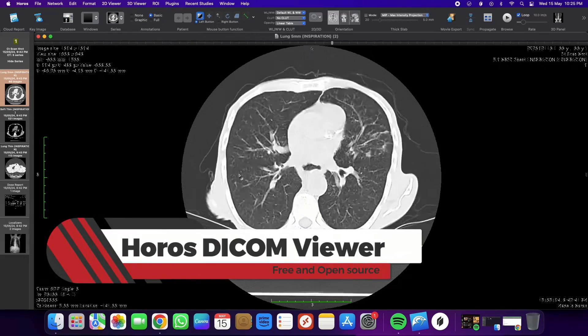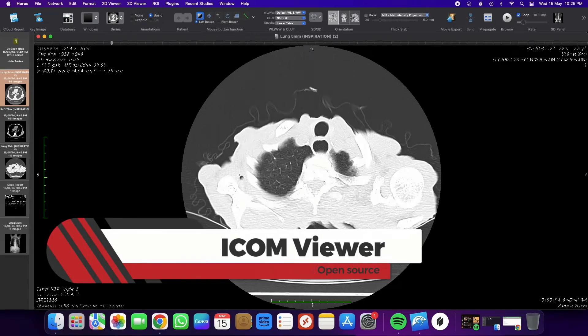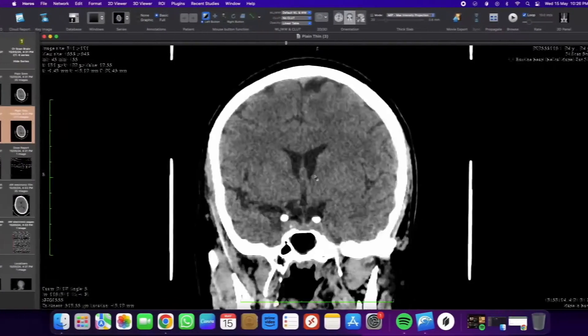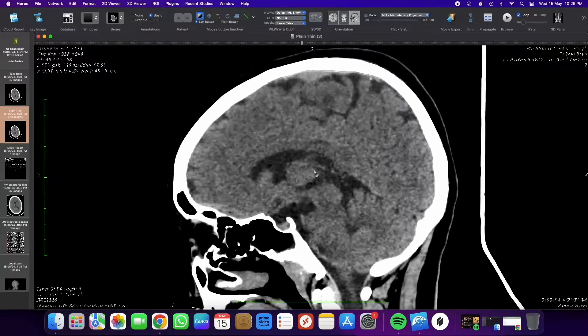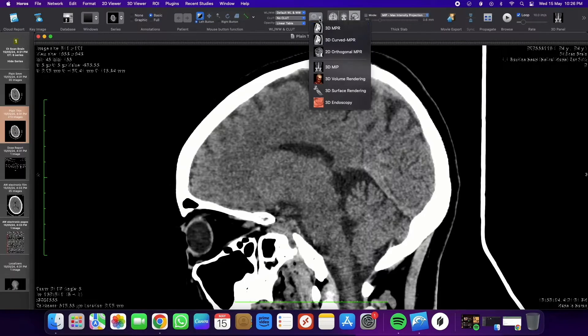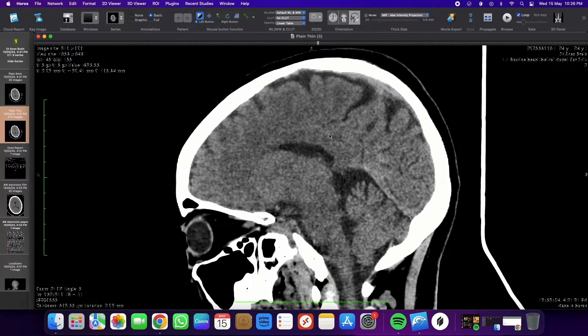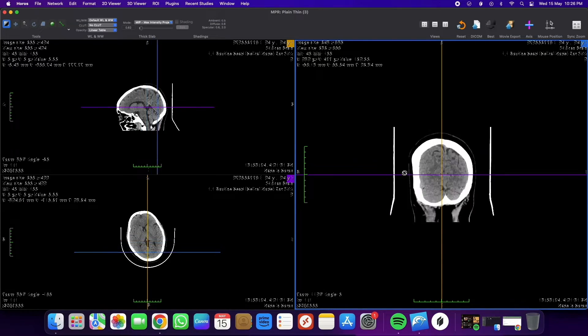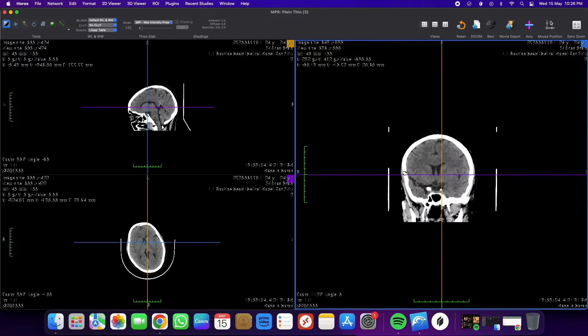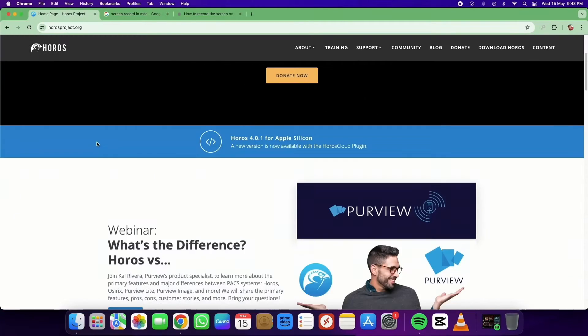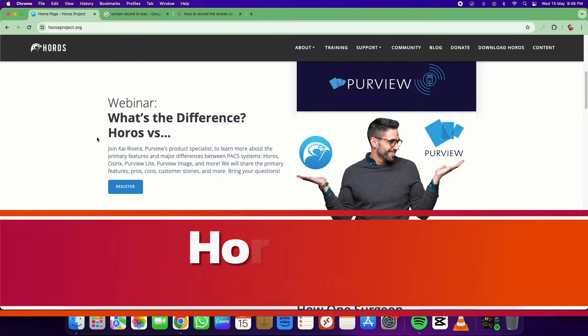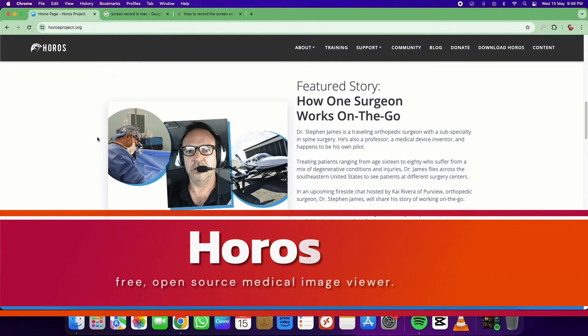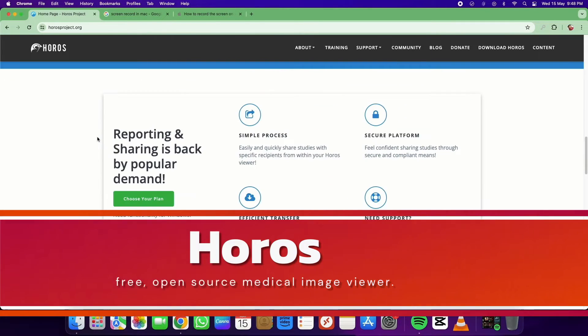Today, we will explore a medical workstation software that provides radiologists with a 360-degree view of DICOM images. Introducing Horos DICOM Viewer, a free and open-source software for macOS only.